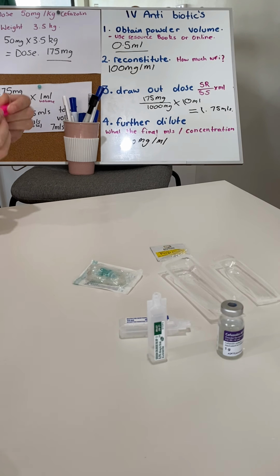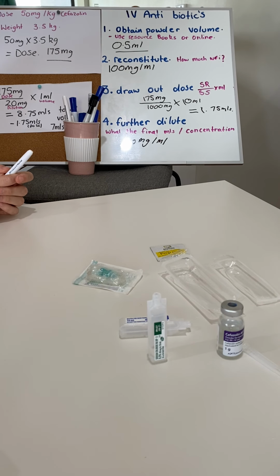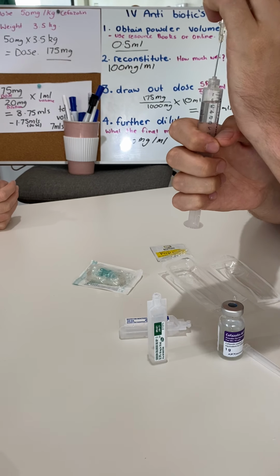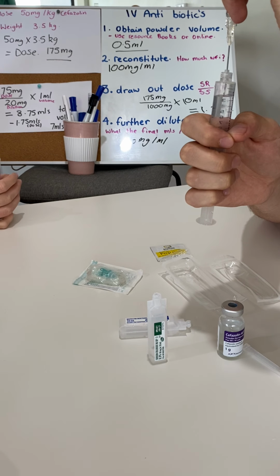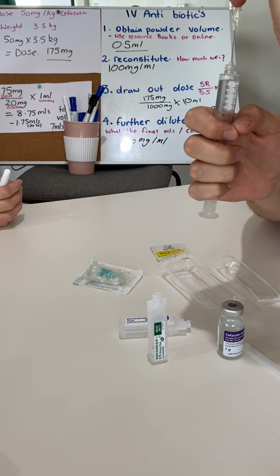All right, and we check this final step with our buddy nurse as well. Beautiful. And then we mix our dose in with the normal saline that we've mixed. So today we're going to give this through a syringe driver. So we're also going to have to prime a line to connect it to our baby.